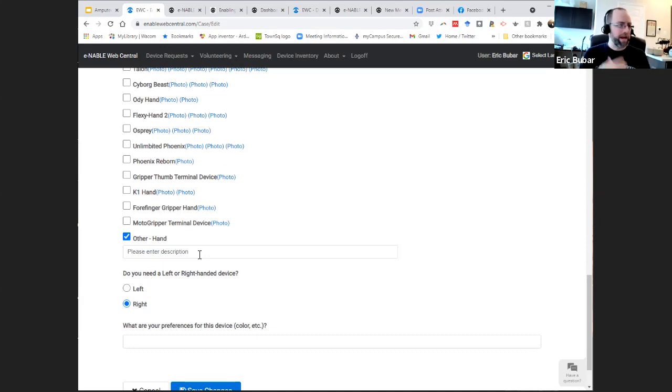I know that the NIOP developer, Nate Monroe, being an amputee himself, is very cognizant of that and is trying to bring the weight down and make it as modular and plug and play as possible with other options, especially for sockets, because that's an area that's tough for volunteers to do properly.